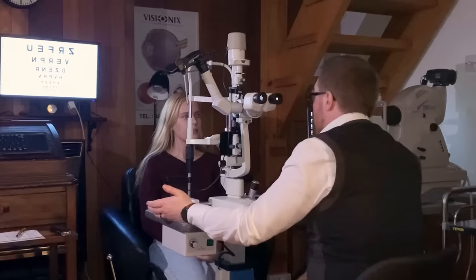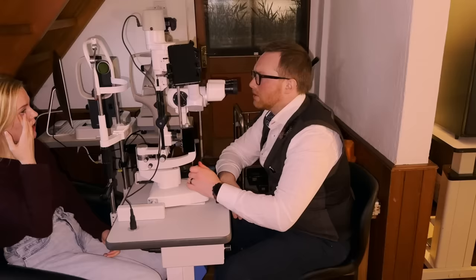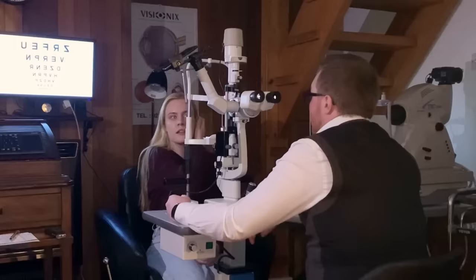What I'll do is I'll quickly get a photograph of it, and then we've got that for visual reference, because it's very good to measure these things. Okay. Has anyone ever mentioned a freckle in your eye before? I think last time was the first time it was mentioned to me. Yeah. They are perfectly harmless, and perfectly normal. Have you ever noticed it? I hadn't noticed it until my last eye exam.